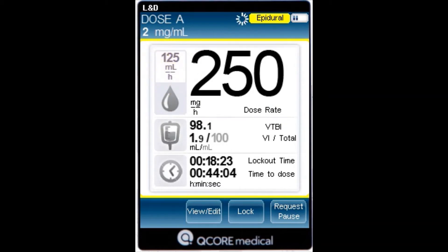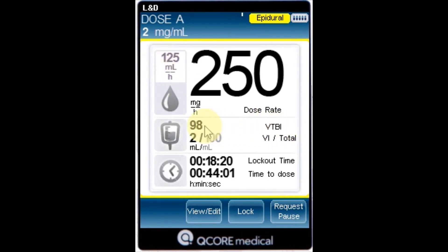VTBI — the total volume left to be infused. As the infusion progresses, this value decreases.